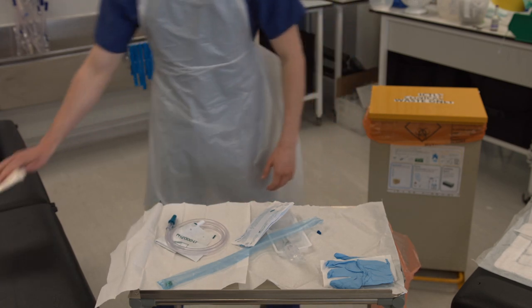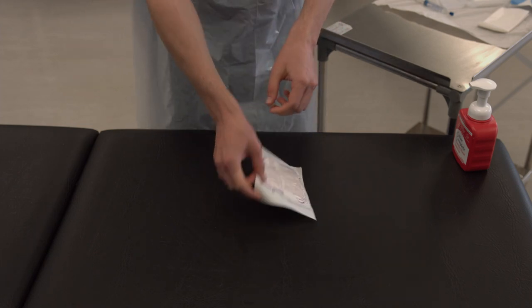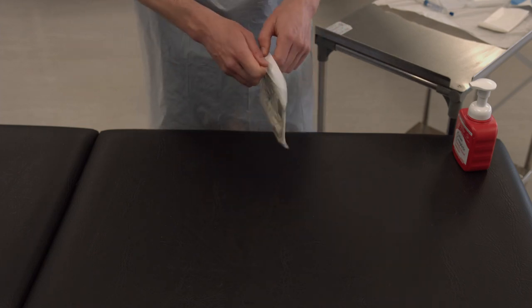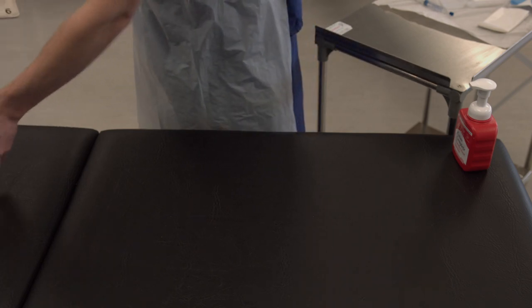Then open the package for your second pair of sterile gloves. Get them ready to put on and then wash your hands using the seven steps of hand hygiene.